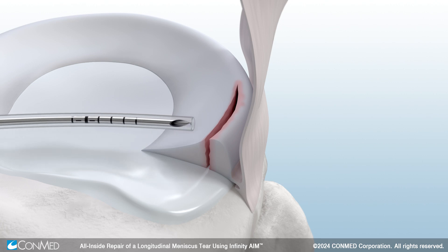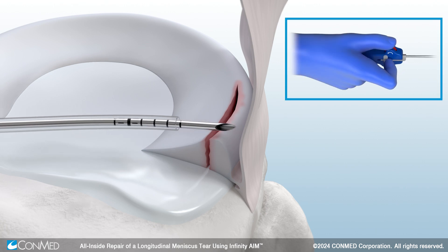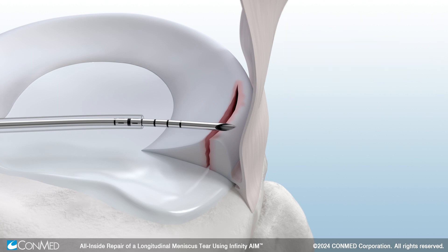Start on the posterior horn. Position the device close to the tear and pull the white sleeve adjuster back to the desired depth using your pointer finger or thumb. The adjustable sheath now exposes the needle.